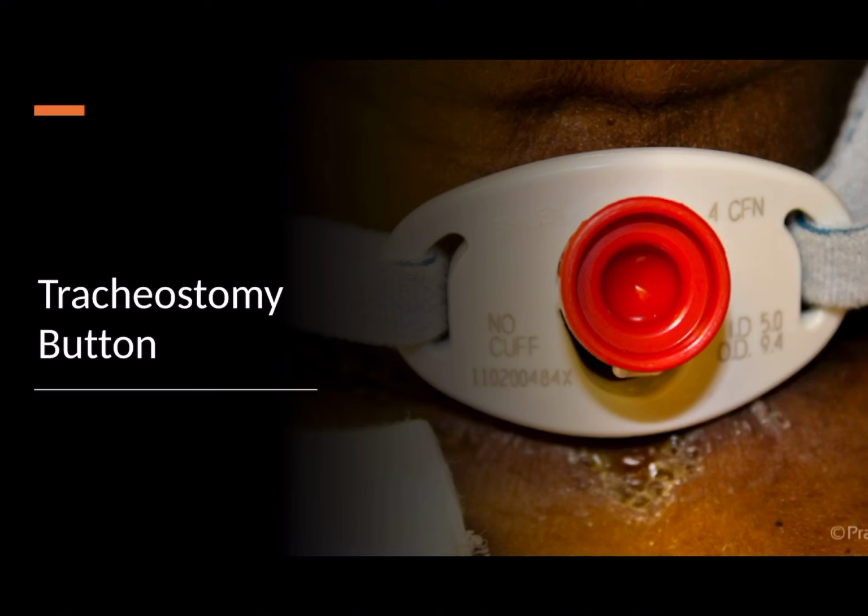However, the patients for whom this can sometimes be used are those with long-term tracheostomies, who actually need it more, for example if they have lots of problems with secretions, so for subglottic suctioning, or for patients who have sleep apnea, where they don't need their tracheostomy during the day, they just need it overnight when they need to be ventilated. So you might see some people weaning patients and seeing whether they can cope without the tracheostomy by capping it off. The important thing again is that it is red.